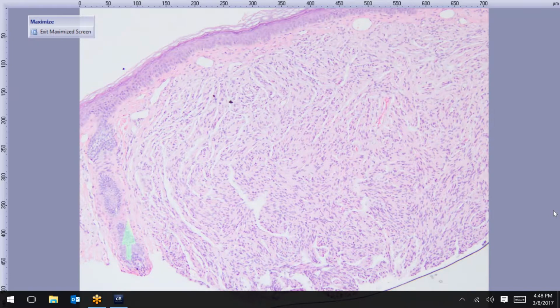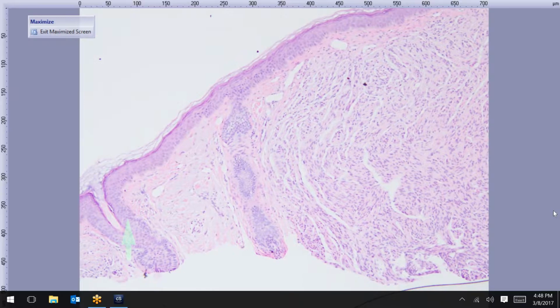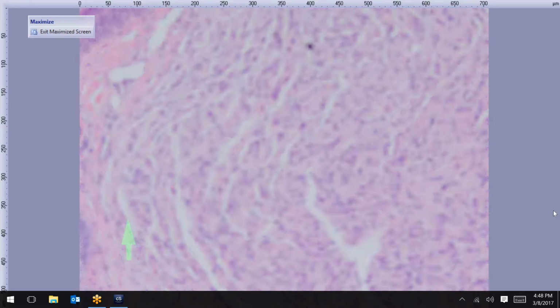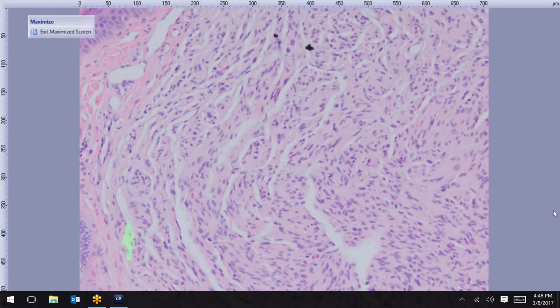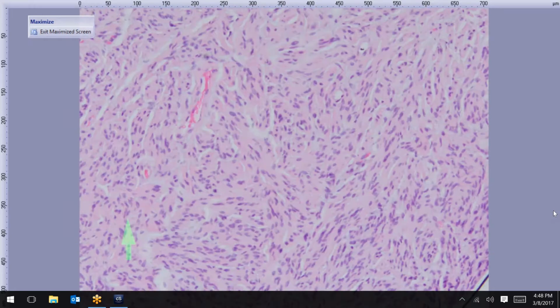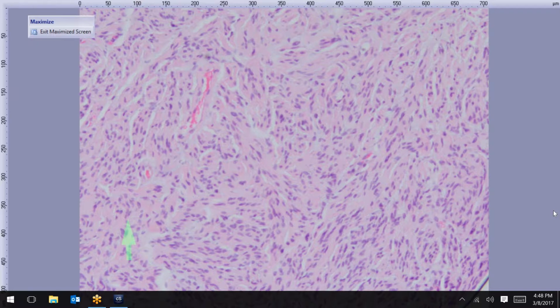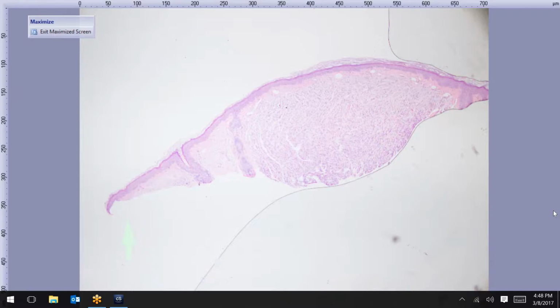Okay. Yeah, so this is a pretty well demarcated upper dermis proliferation of some kind of elongated wavy spindle cells. And we got some so-called fracturing within it. And so, yeah, this is a neural neoplasm, and it is palisaded encapsulated neuroma. PEN, good example.